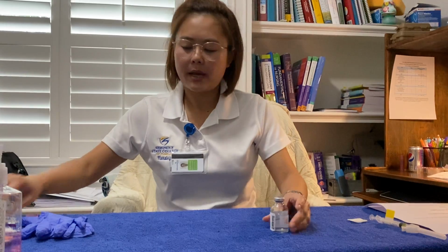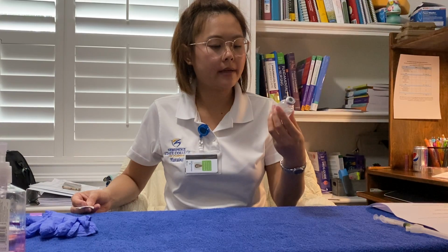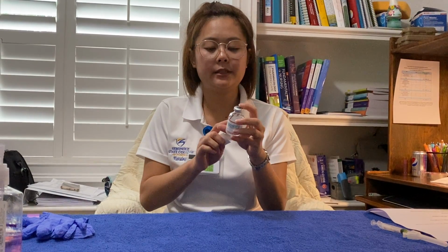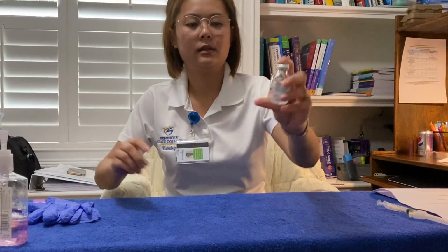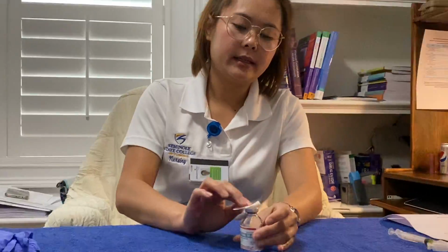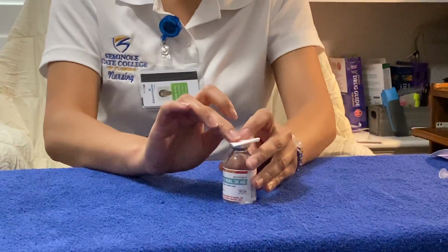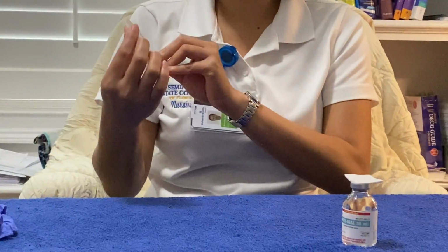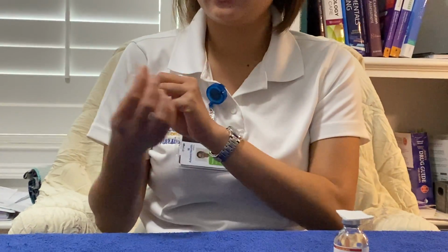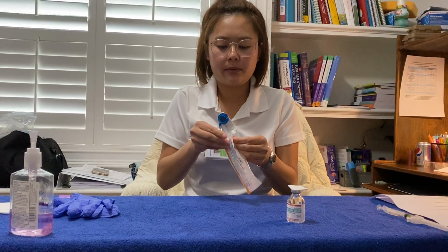Okay, my B12. This is a multi-dose vial, so when I first open it, I need to put the date, the time, and my initials. Then open it and clean it for 20 to 30 seconds with an alcohol pad, and leave it there so I know I cleaned it. Then I use my subcu injection syringe and needle, which is 1 ml, 25 gauge, 5/8 inch. Peel it like a banana peel.